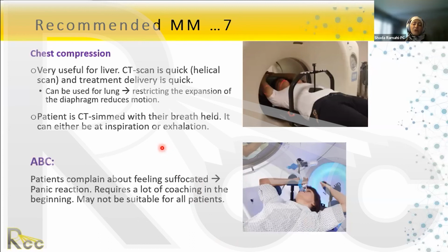However, another school of thought: we have two physicians who also do a 4D CT phase scan with chest compression. So we do a chest compression, narrow, let's say 2 millimeter, 2.5 millimeter scan, and we're done. And then we do another 4D CT with the chest compression.